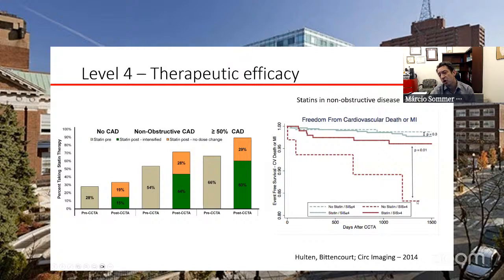But once you have more plaque, which is to us with SIS greater than 4, you can see the statins improve prognosis. There's other studies that have kind of showed the same afterwards, but it's the idea that the amount of plaque that we see can guide, can inform us on managing the patients for at least some of the clinical information, and that can have impact in prognosis.